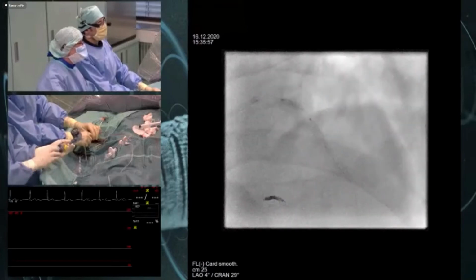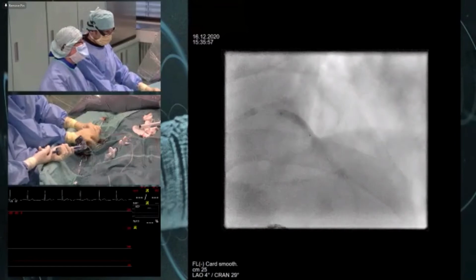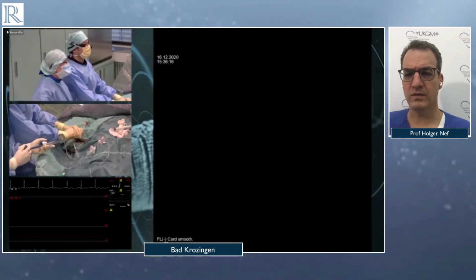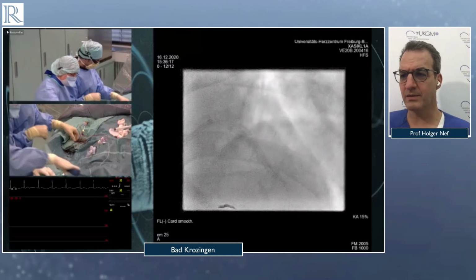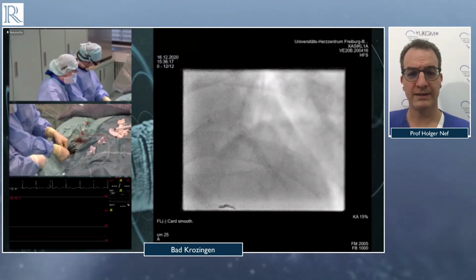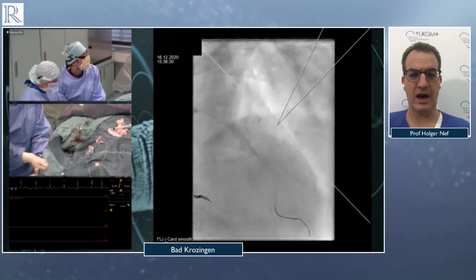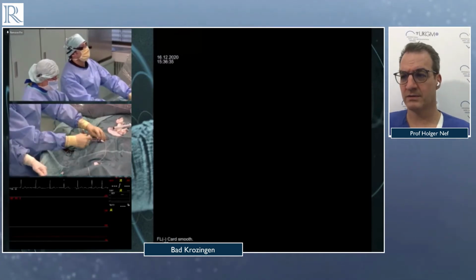The question is, you show us nicely the Sapphire, microfractures, disruption of the calcification, high pressure. And the question is, do we need also this kind of evidence by the OCT? And do we also need to ensure that there is this kind of fractures, or do you have other evidence that your IVL has worked?